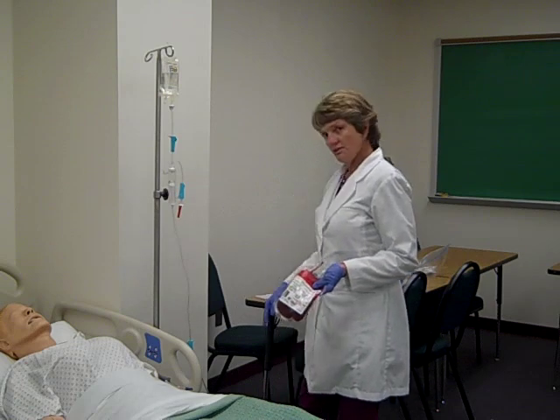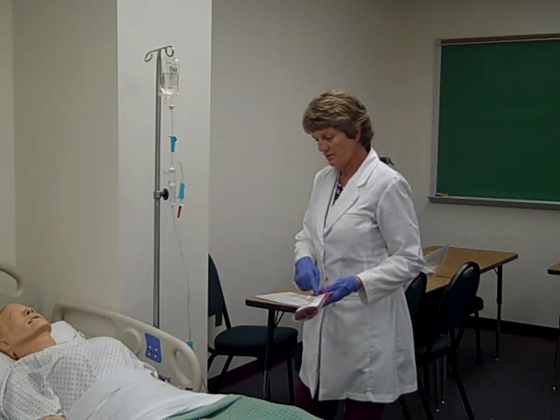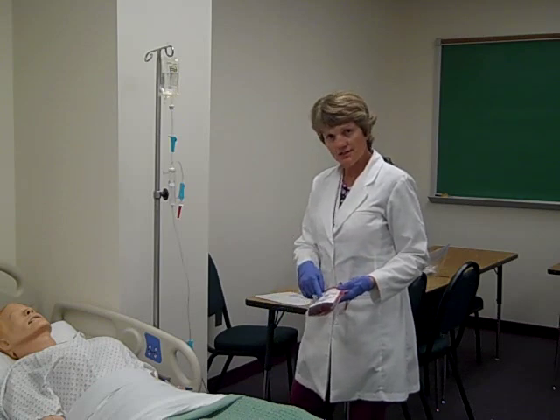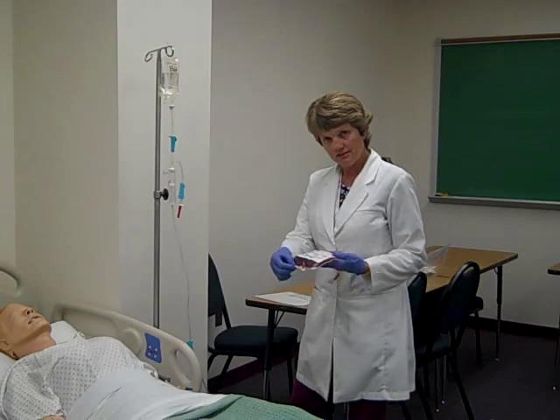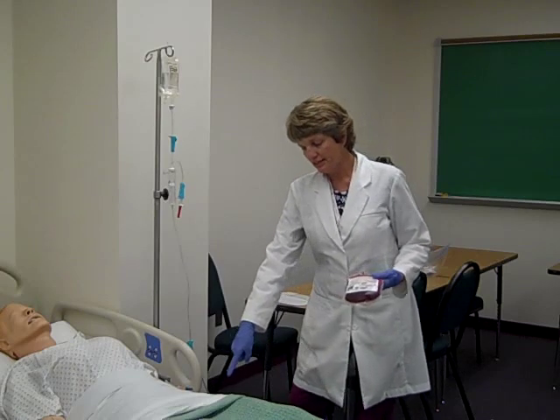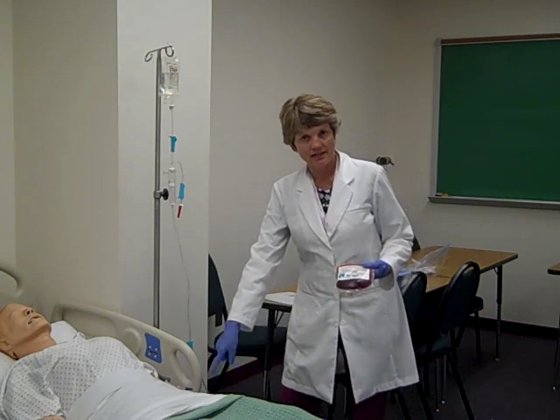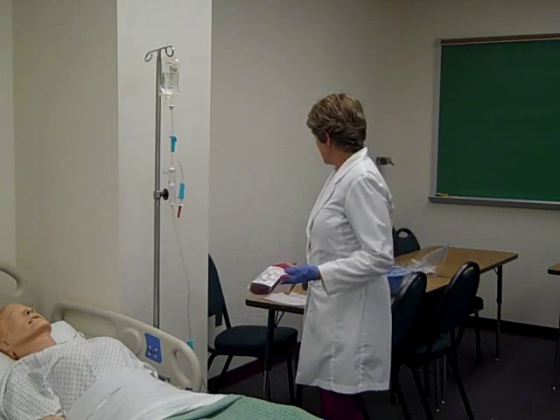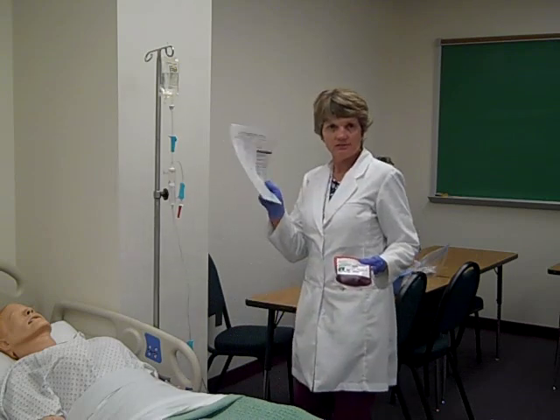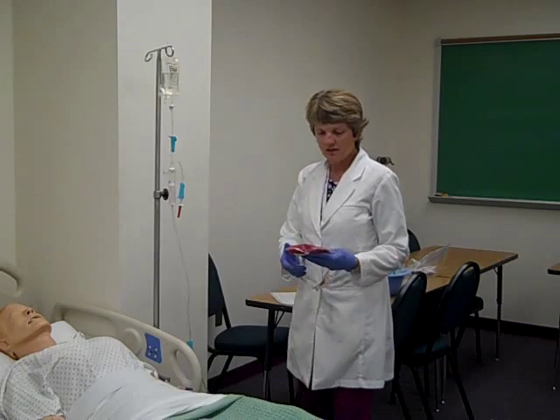So as you noticed, when Ms. Mack and I were checking this and verifying this unit of blood and the information that we needed to check, we were looking at the requisition that's coming off the blood bag, we're looking at the patient's arm band, plus the blood band, should they have one. Not every patient's going to have a blood band or a blood ID number. And we were looking at the requisition form. Okay, so we're matching all that information.